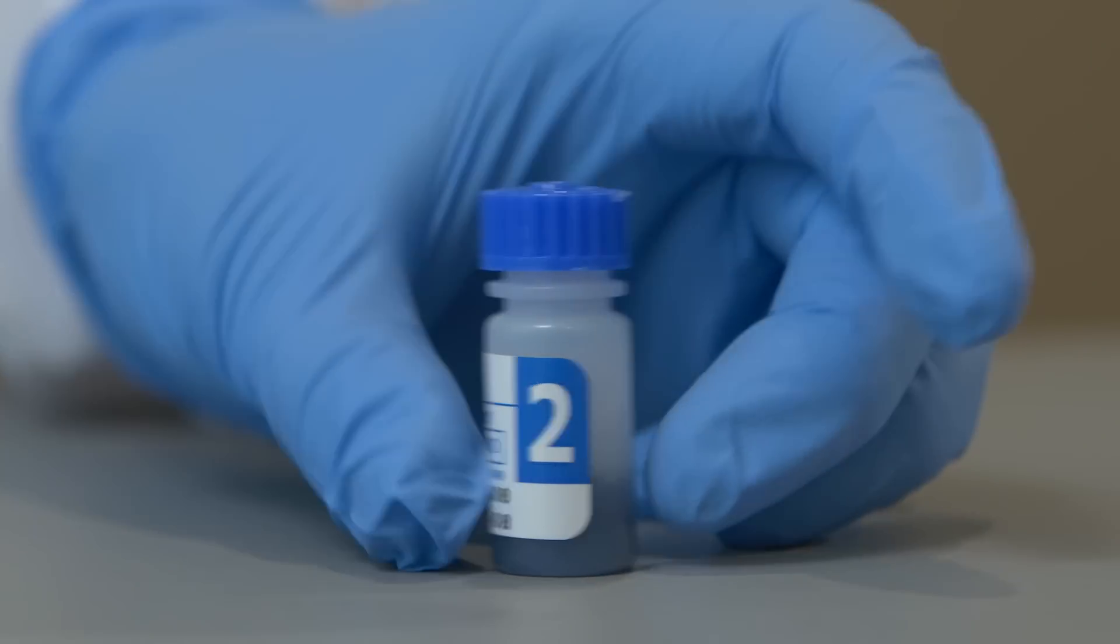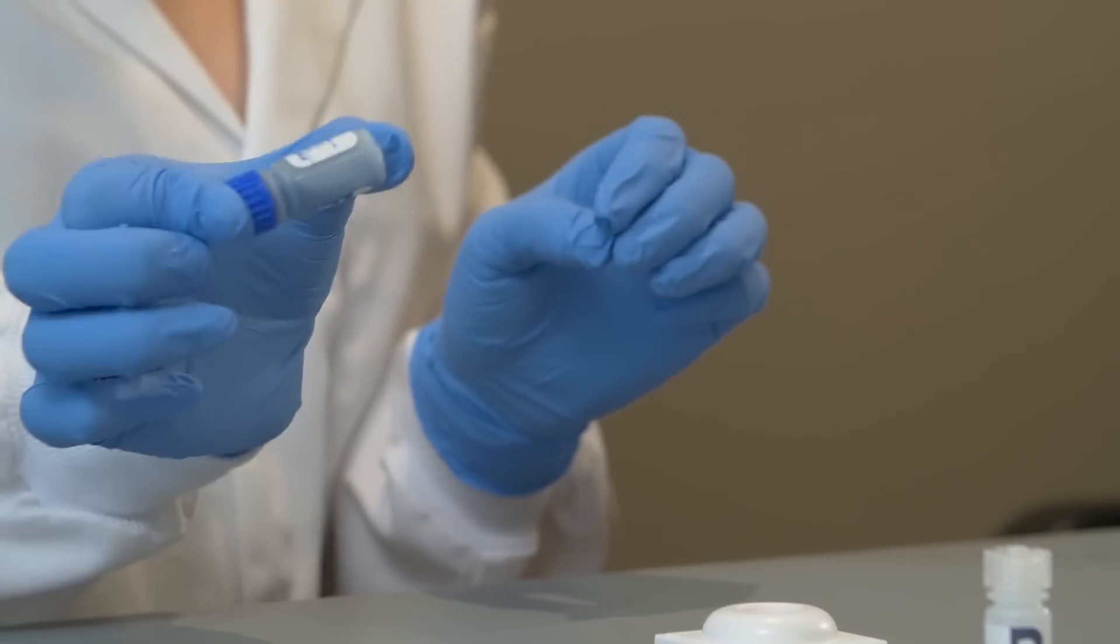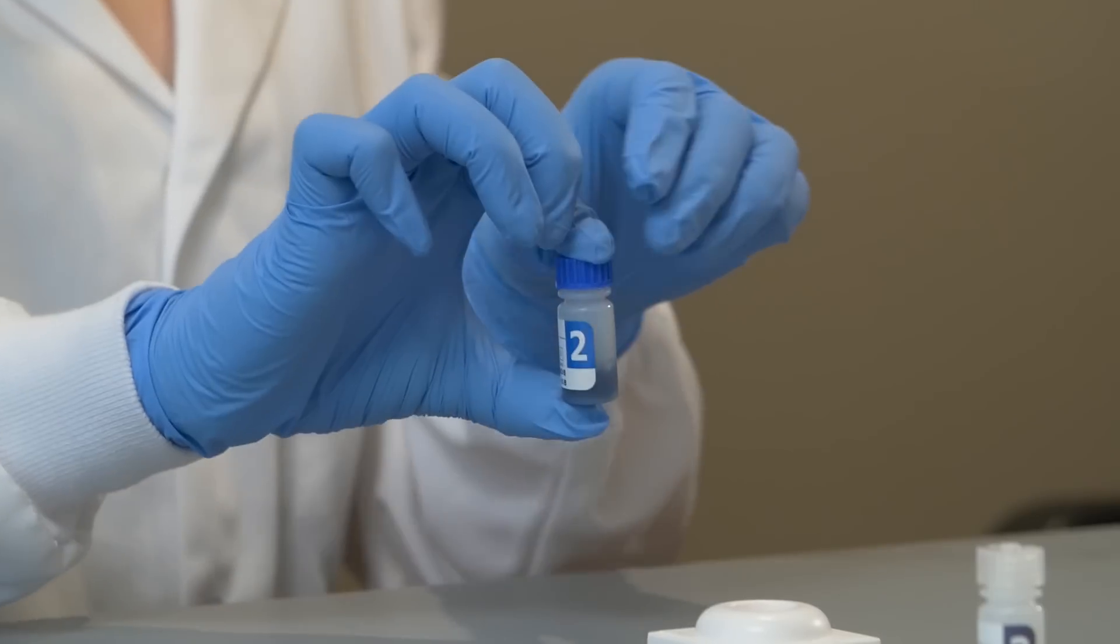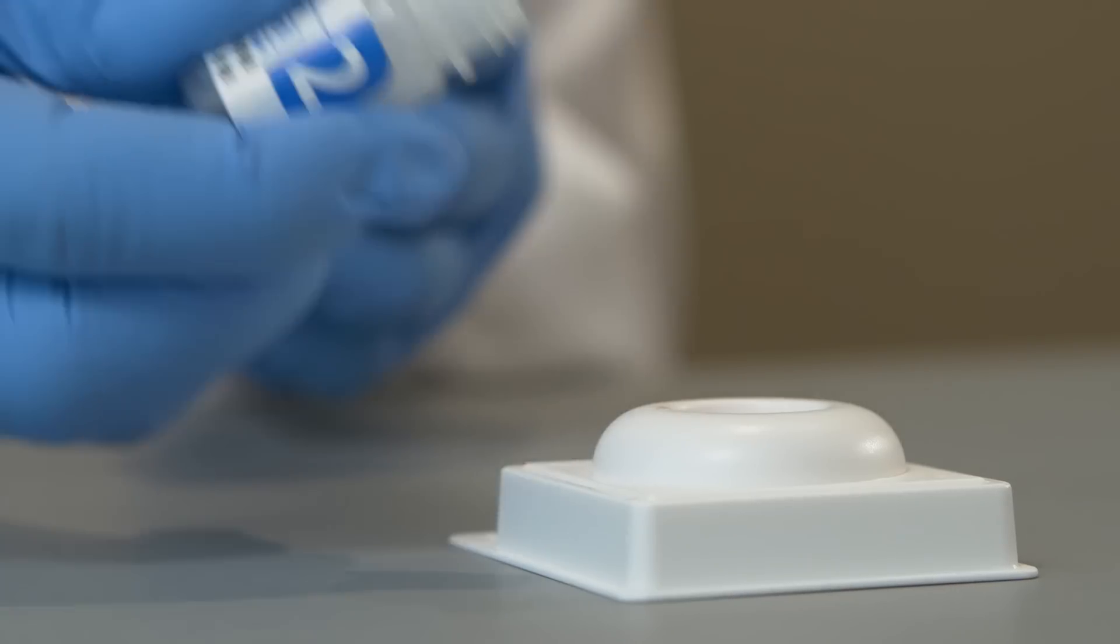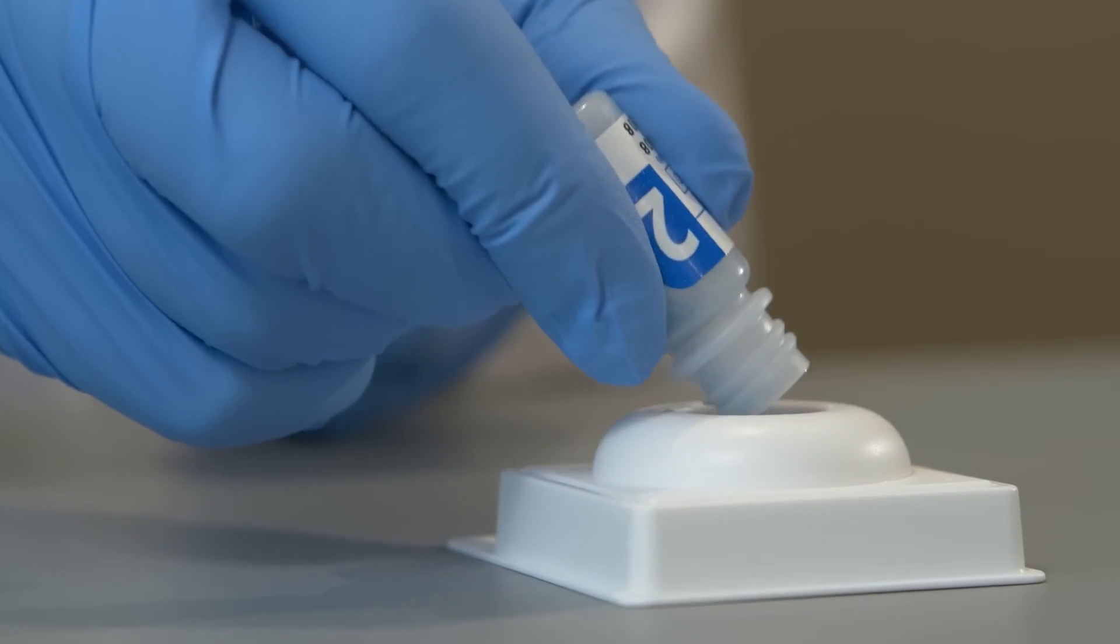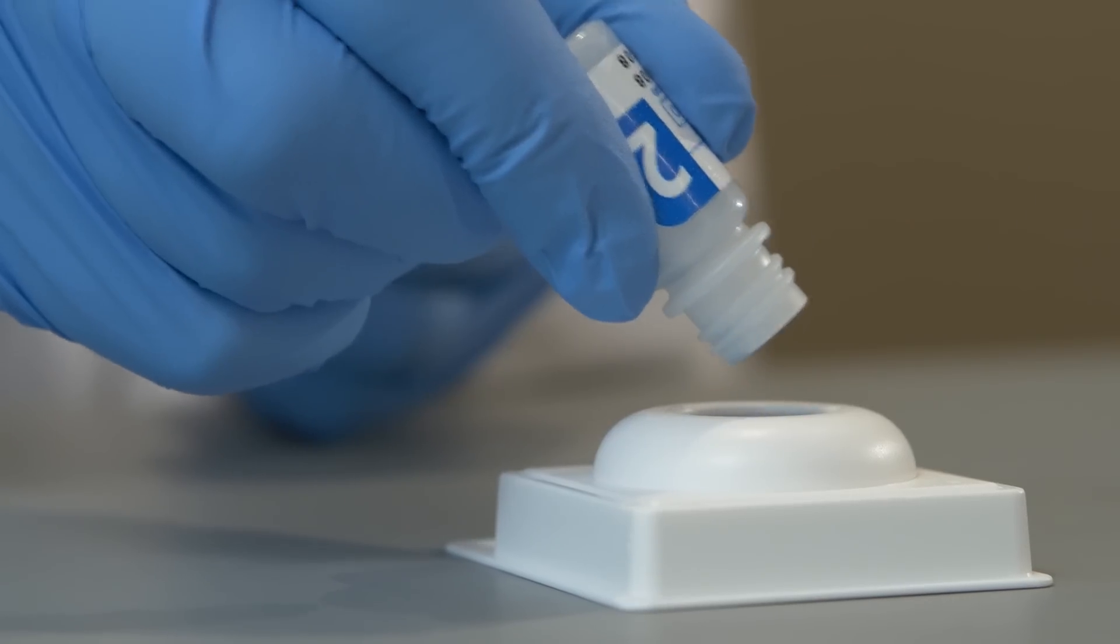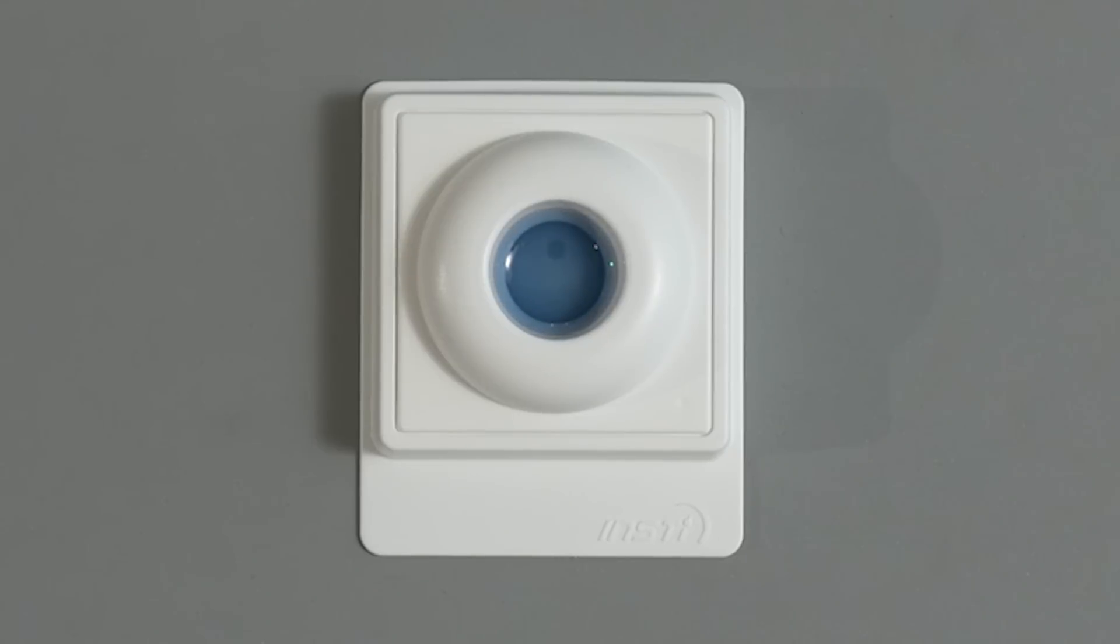Resuspend the color developer by slowly inverting. Mix the solution thoroughly until the reagent is evenly suspended. Pour the entire contents of bottle number two into the centre of the membrane unit. The solution should be absorbed quickly. Wait for the solution to be absorbed completely.